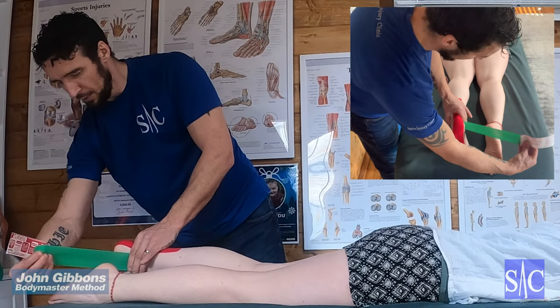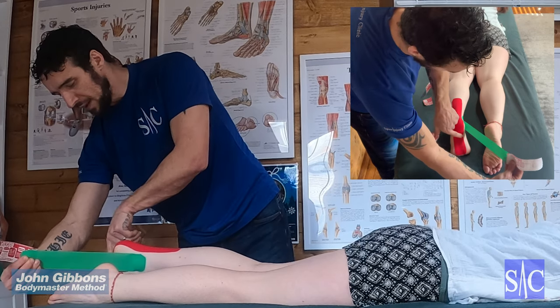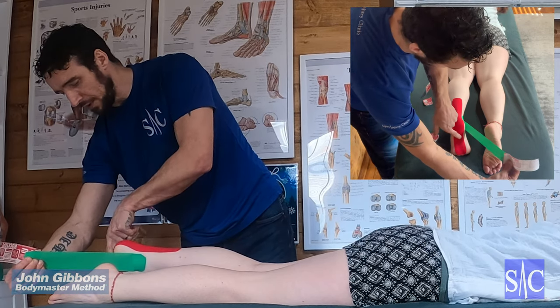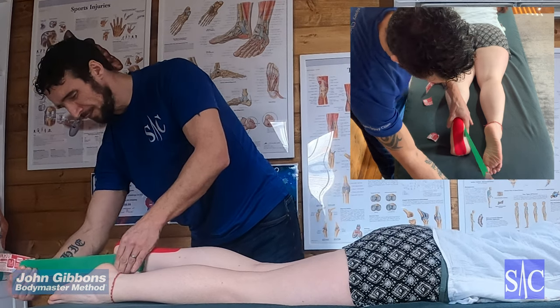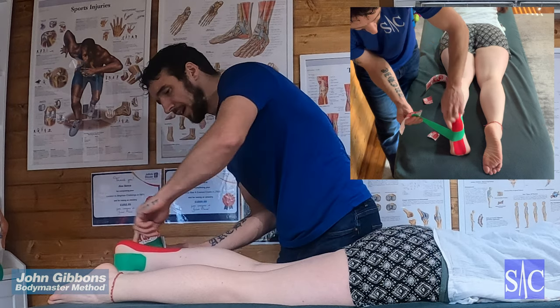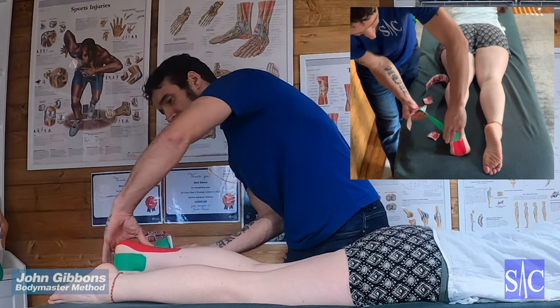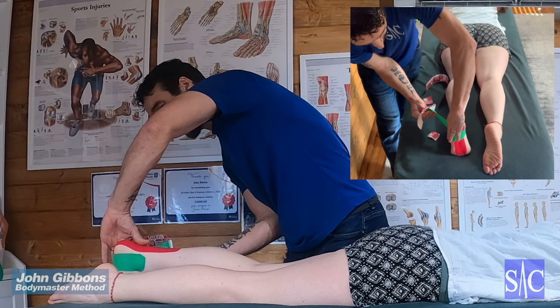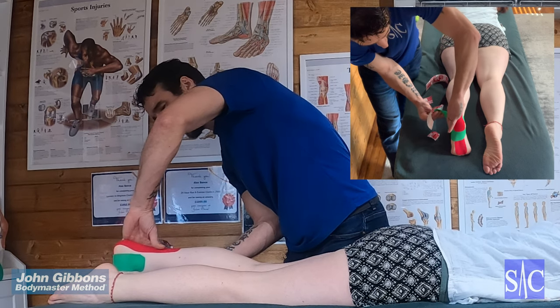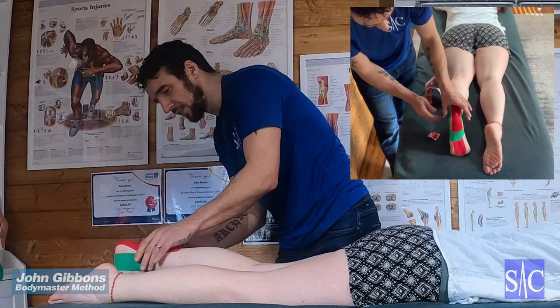Pull the tape to a hundred percent stretch, trying to cross over the painful points through the sole of the foot — this is where we're trying to cross over, at a hundred percent. Then aim for the outside ankle bone and up the leg. As you come over that, back off to fifty percent stretch until the end, finishing with no stretch at all.